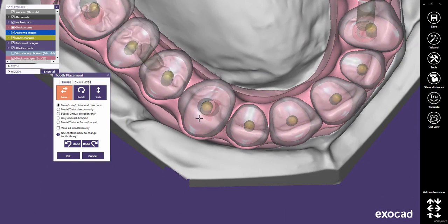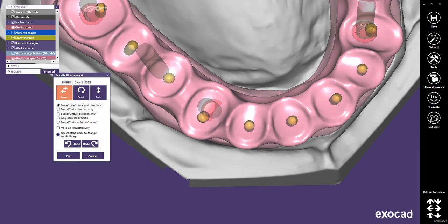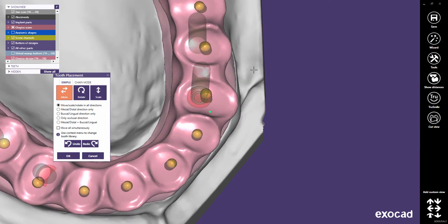On teeth with implants, I try to avoid placing the retentions in the areas of the screw channels, as the screw channels may cut away parts of the retentions.